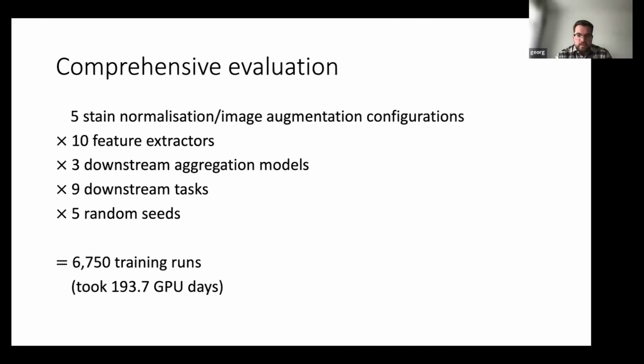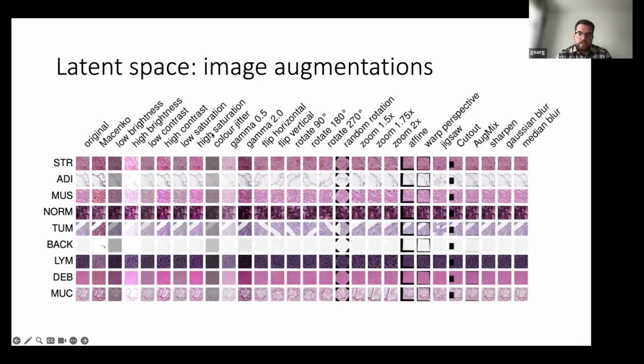And to be specific, these are the augmentations. Basically, for every patch during training at every epoch, you randomly select one of these augmentations to perform. So in terms of using stain normalization as an augmentation, is that the case of you've got one target image and you're stain normalizing all the patches to that one? To that one target image, which we chose before training. Yeah. Thank you.